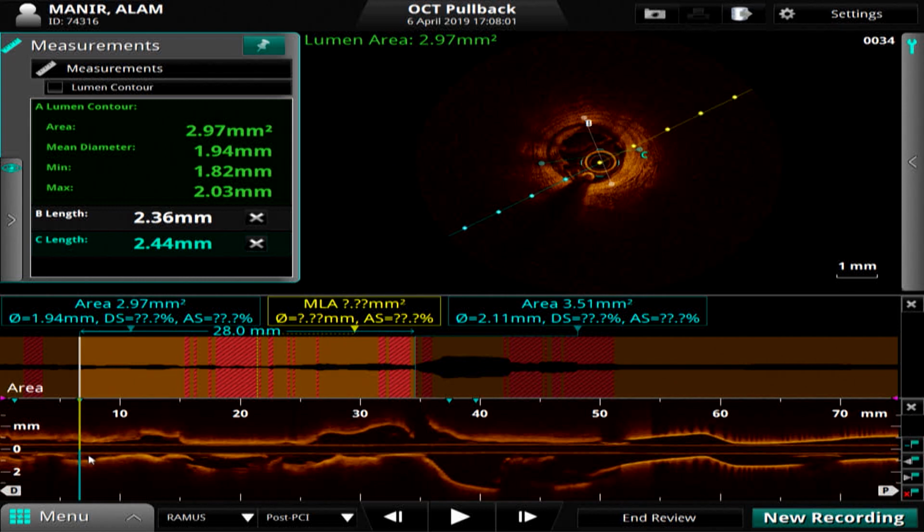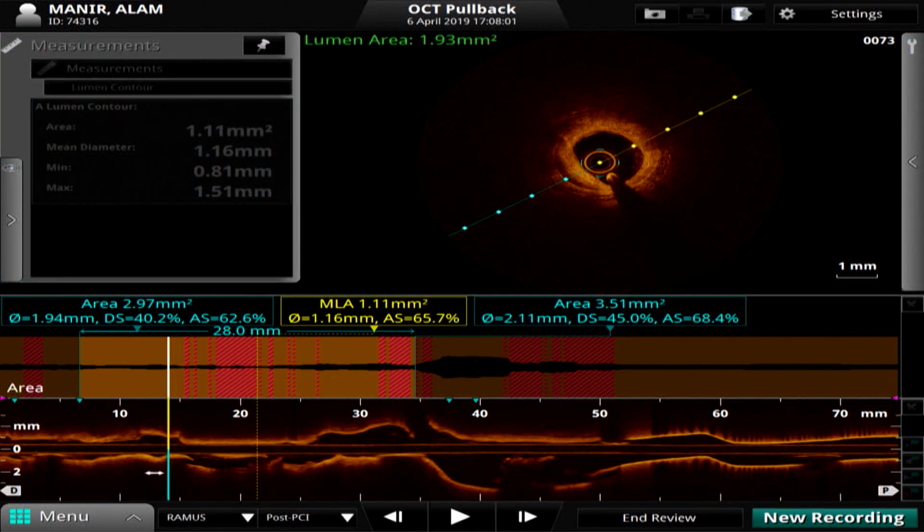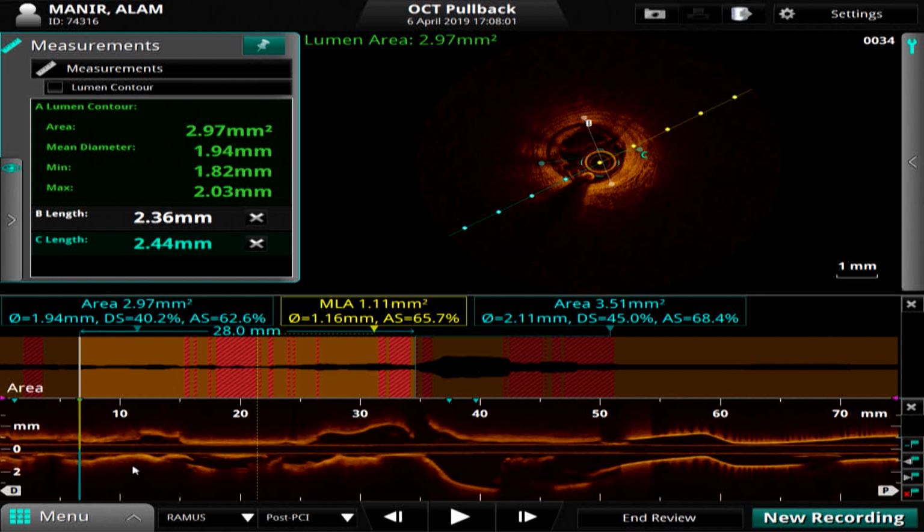Dr. Raj, as you have rightly said, there is a lot of space between the ostium of the LAD and the ramus. So what is your take about doing two ostial stenting separately rather than doing simultaneous kissing V-stenting? Here there is no need for simultaneous V. We're going to put a stent in the ramus branch first, and then we're going to put a stent into the LAD. Interesting, because both the lesions don't have any extension into the main vessel.